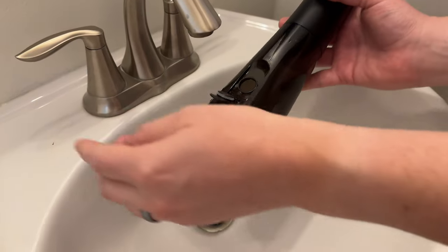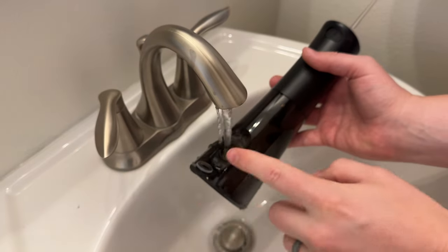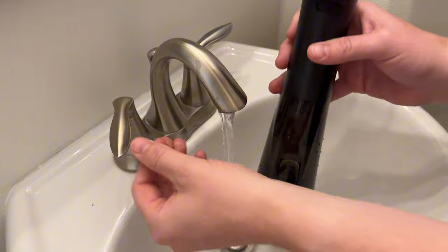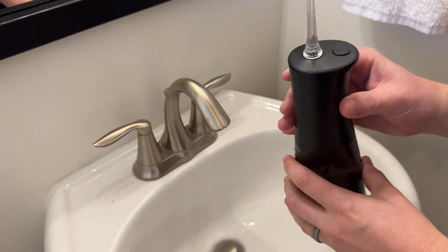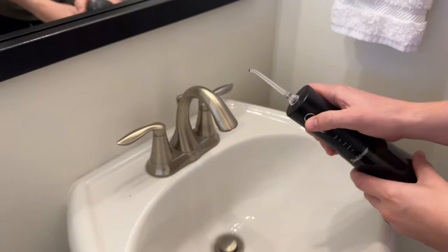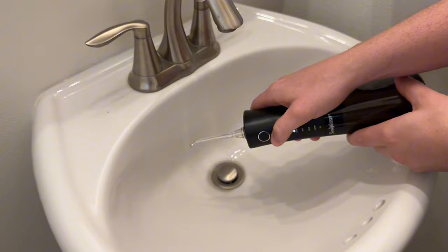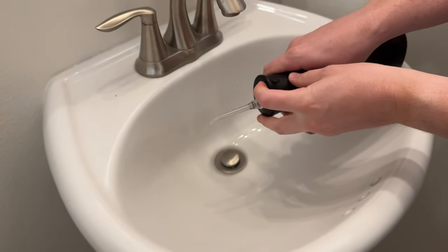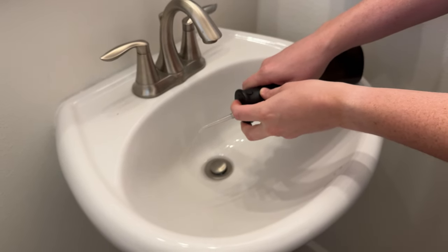To fill it up, we're going to pop this open and put some water in it. The nice thing is you could add a little mouthwash or other things — it's not just water, you could also add warm water. We're going to turn this on, which is just this on/off button on the side, and now it's going to start to squirt. There's a button on the top which allows the nozzle to rotate.